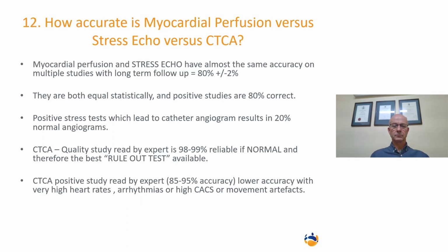Peter, I think you've touched on this, but this is the next question we've had. How accurate is myocardial perfusion versus stress echo versus CTCA?